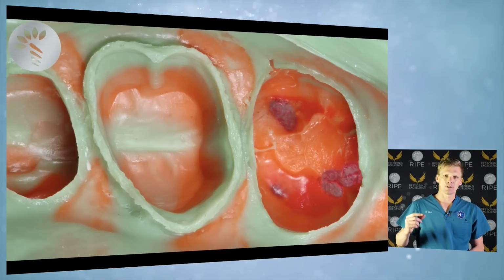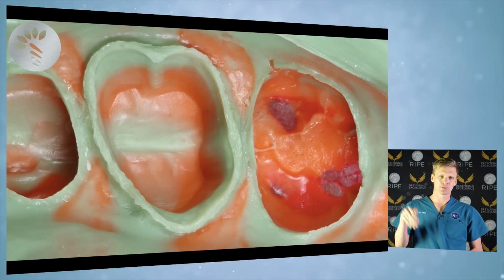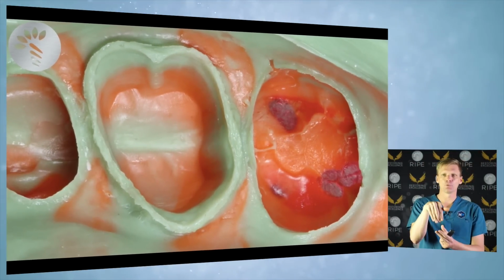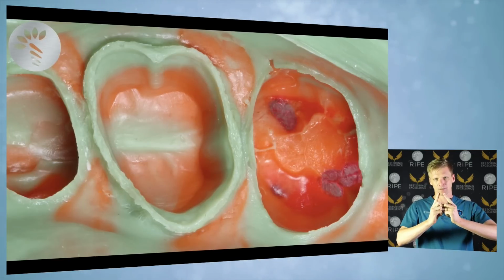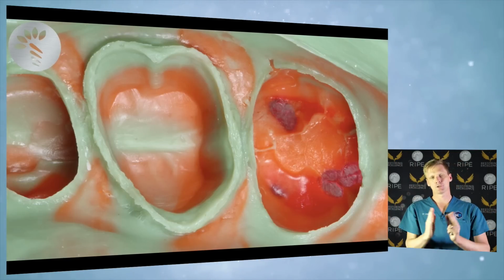When you retract, you need lateral retraction and you need it wide, and this is because, once again, it's to do with the surface tension of silicone running over the tooth. So silicone runs down the side of the tooth and then it will go into the sulcus, but it can't go into the sulcus easily if it's really thin. So if you've got a very tiny gap, it's very hard for the silicone to run down into that gap because the gap is too narrow.